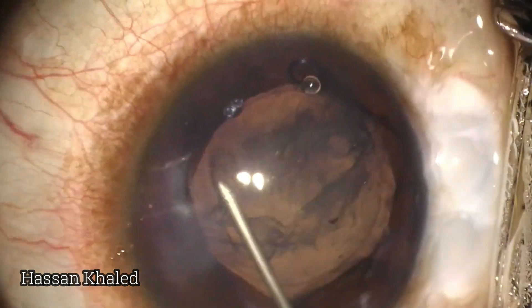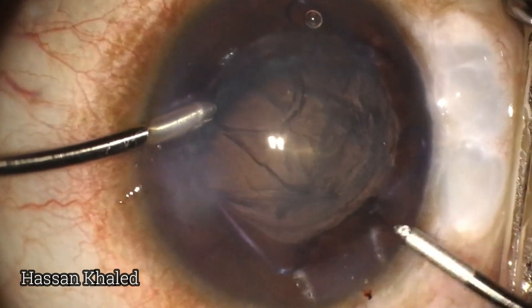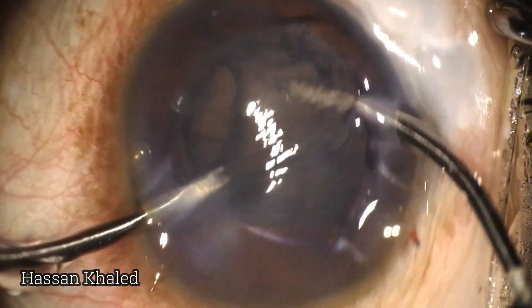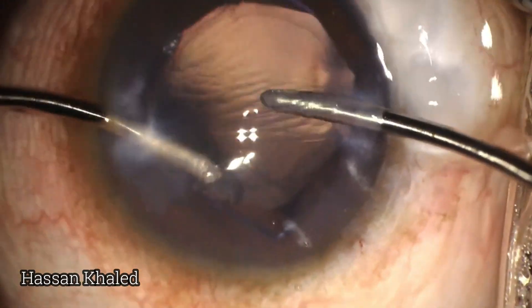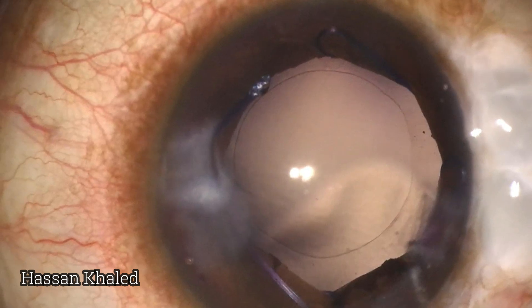I then performed hydrodissection with gentle hydro-delineation. As this type of cataract is soft, I used manual irrigation-aspiration to remove it, and it was easy to remove. Here you can see the diameter of the capsulorhexis, which is very good.